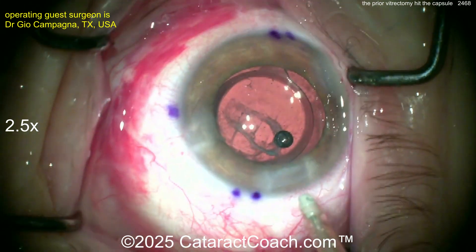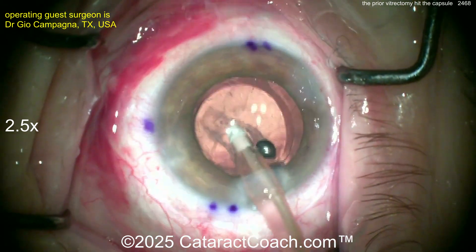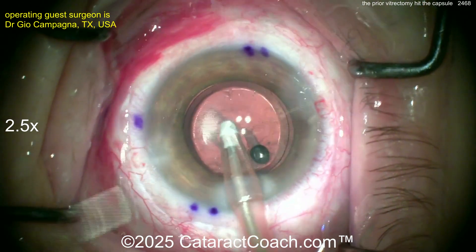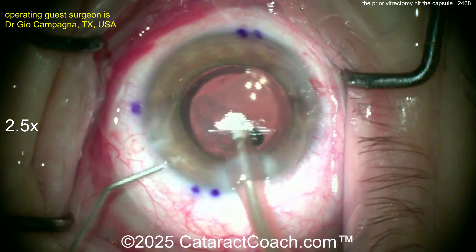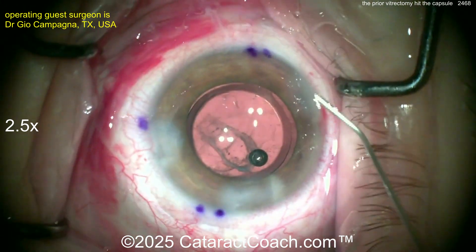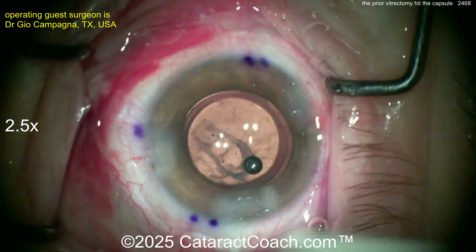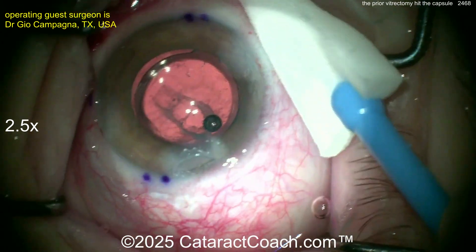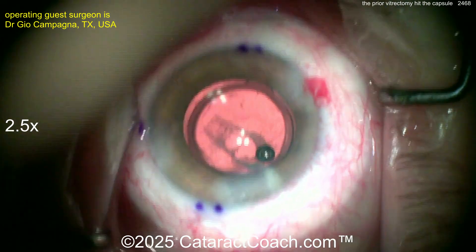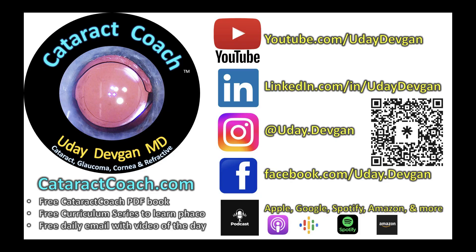Sealing up the incisions. A little more gentle aspiration of viscoelastic — I'd drop my settings in half: half the flow, half the vacuum, half the infusion pressure. Nice and easy. At the end, I like the injection of BSS at the same time as coming out of the eye — don't let that AC collapse. Do a YAG laser later for the patient — I'd wait at least a month, then do a YAG laser capsulotomy. Patient should do great. What a fun and tough case! Remember, Retina Rounds is coming — March 2025. RetinaRounds.com, coming soon.